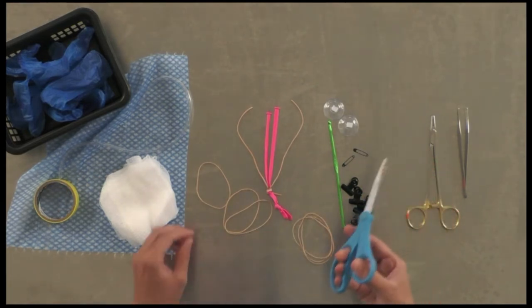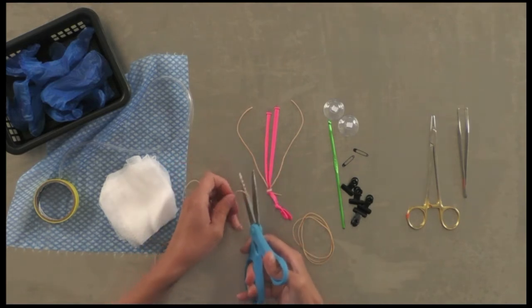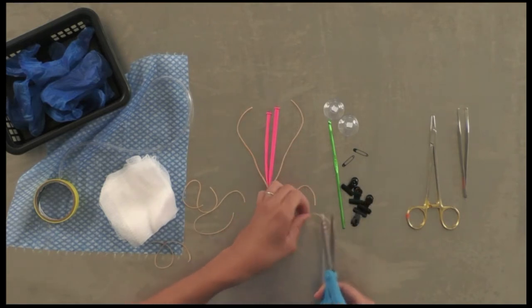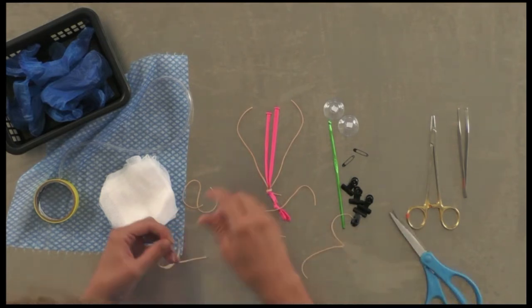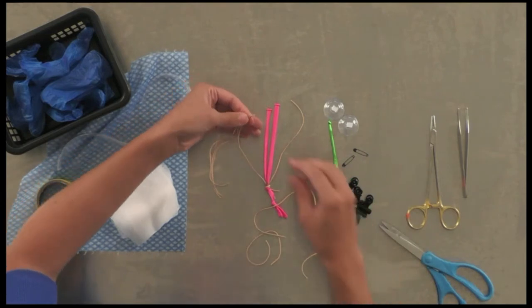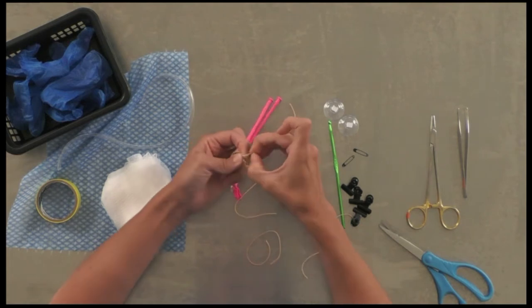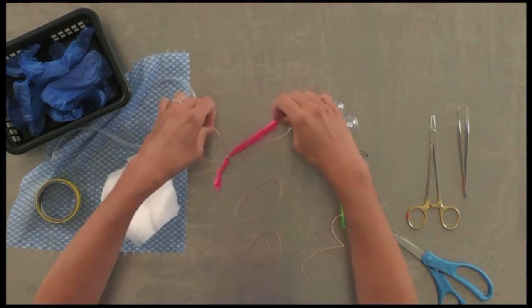Take six rubber bands — three on each side — and give those all a little cut to create three strands on each side. Then take your three ends together, adding that uterine vessel one, and tie a knot. Do the exact same thing on the other side.